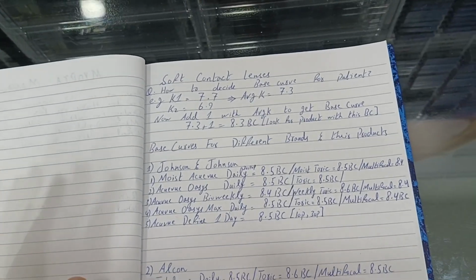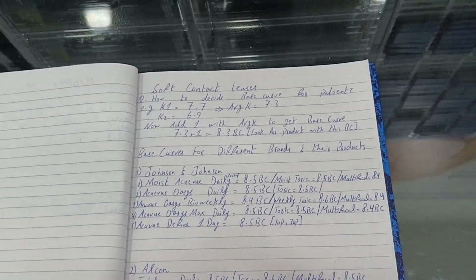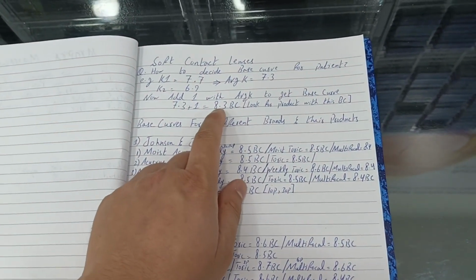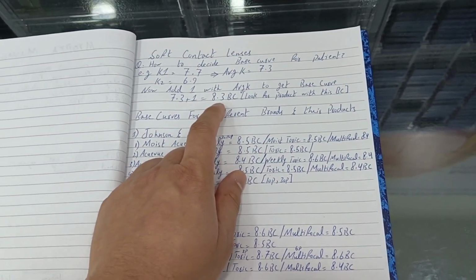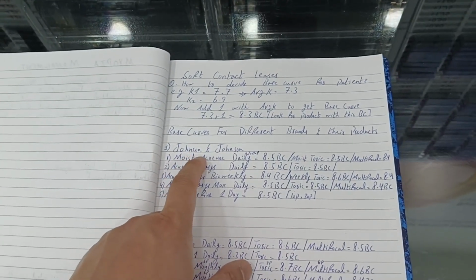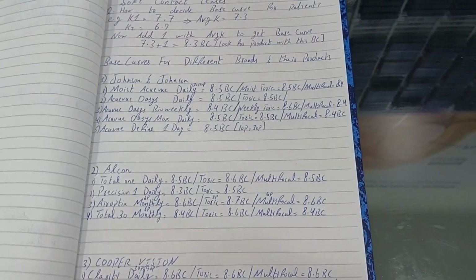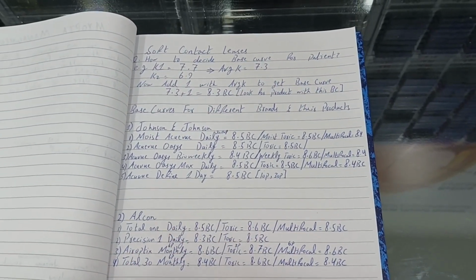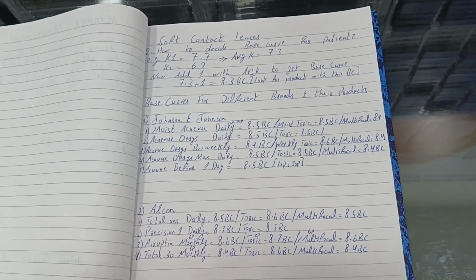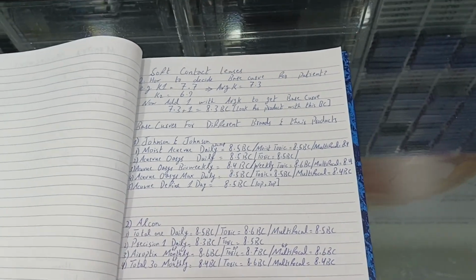And now guys, for the third and final step, how we will choose the product and different brand for our specific customer or patient, which contact lens we are going to prescribe. So already we have done our major part, which is finding the base curve. So it is 8.3. So first we will look for the brands. We can offer our patients a brand. Let's say the most rising one nowadays is Johnson and Johnson. We have Alcon, we have CooperVision. But not everyone is suitable for this patient. The patient can use any one he wants to, but we will tell them that you may feel slight discomfort with this. So if they follow your recommendation, it will be a perfect fit for them.